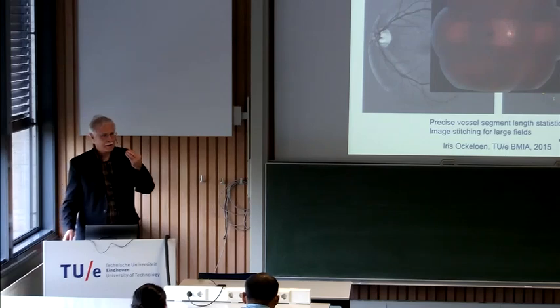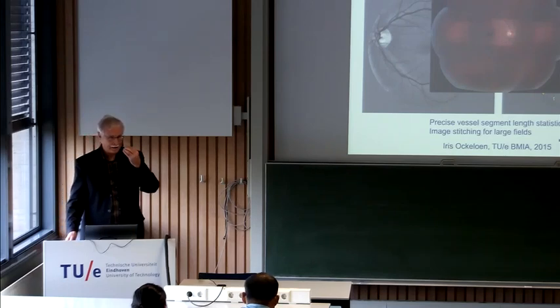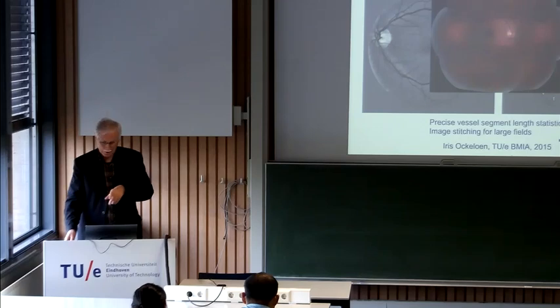So if you have a non-mydriatic camera, as it's called, that camera is capable of taking images through this 2 millimeter hole. And most cameras today are non-mydriatic. But that's a little bit special for the optics.